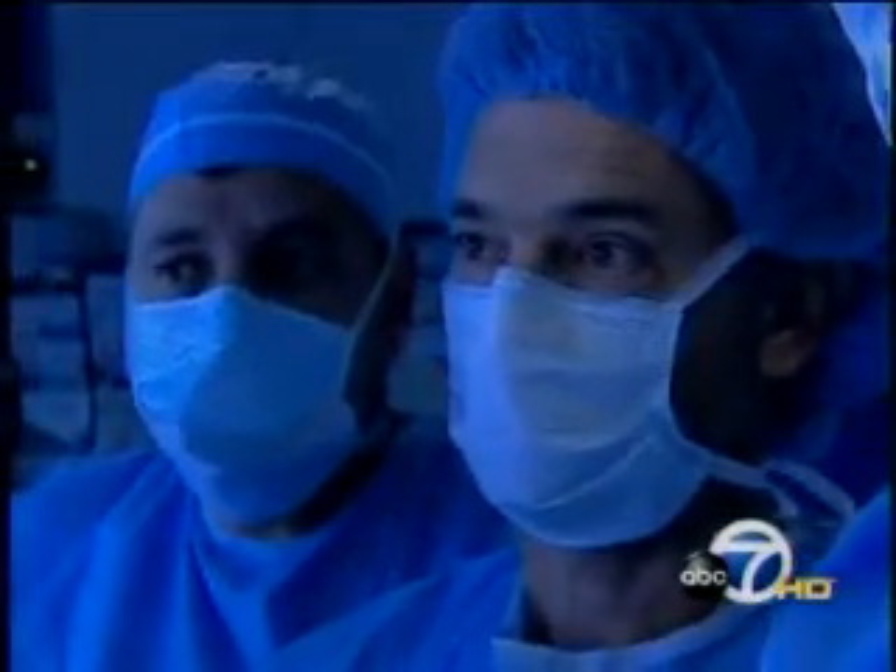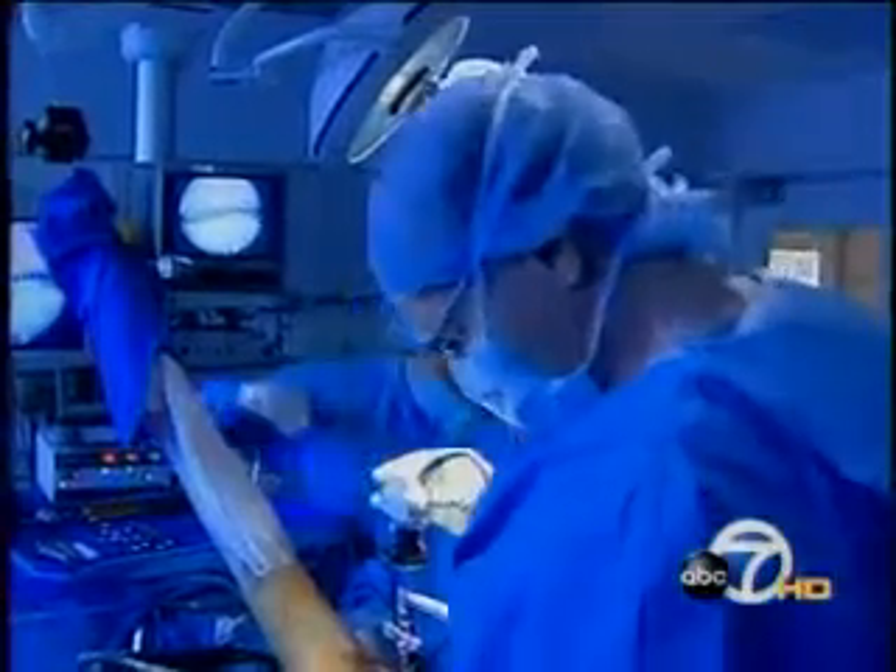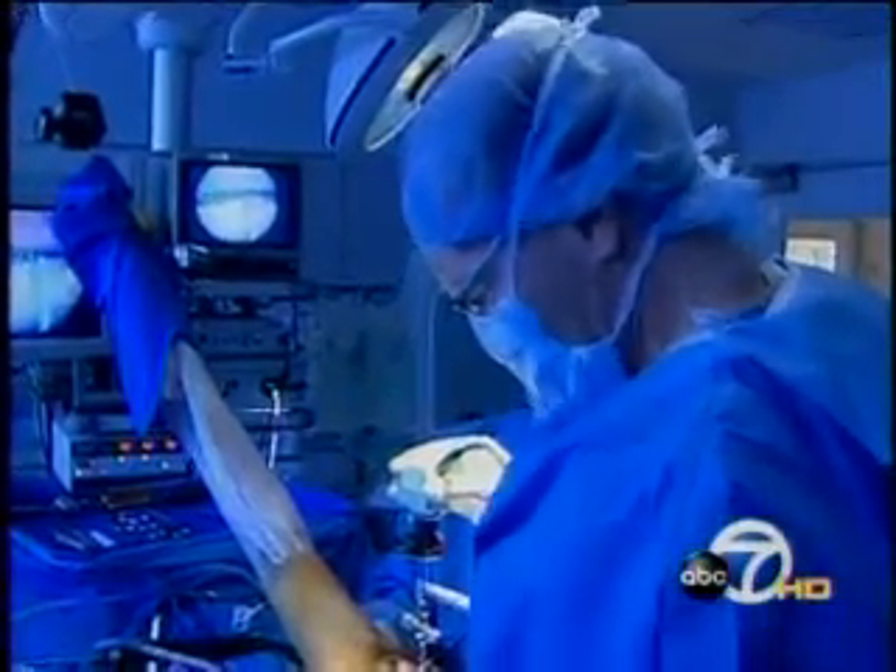After sliding the sutures around the torn tendon, he can pull that tendon into place. The result: less time in surgery and quicker recovery. They've been able to get back to their activities with, seemingly to me, less pain and excellent recovery. Ruth Freeman is one of his successes.